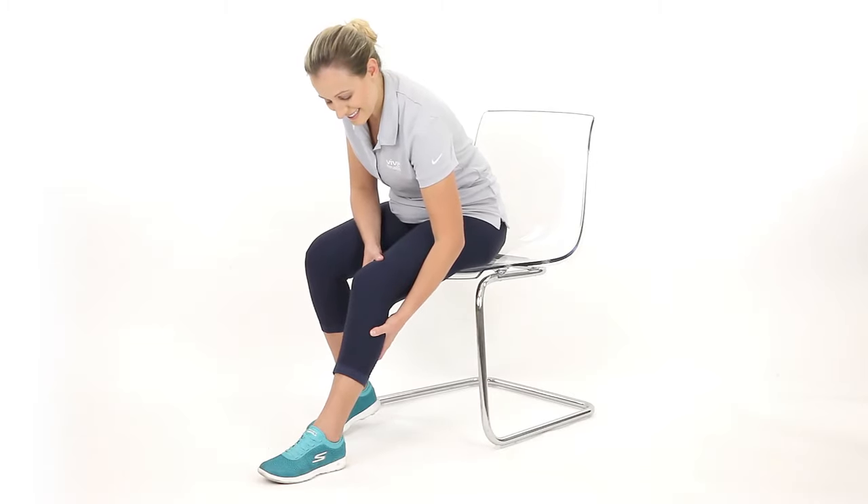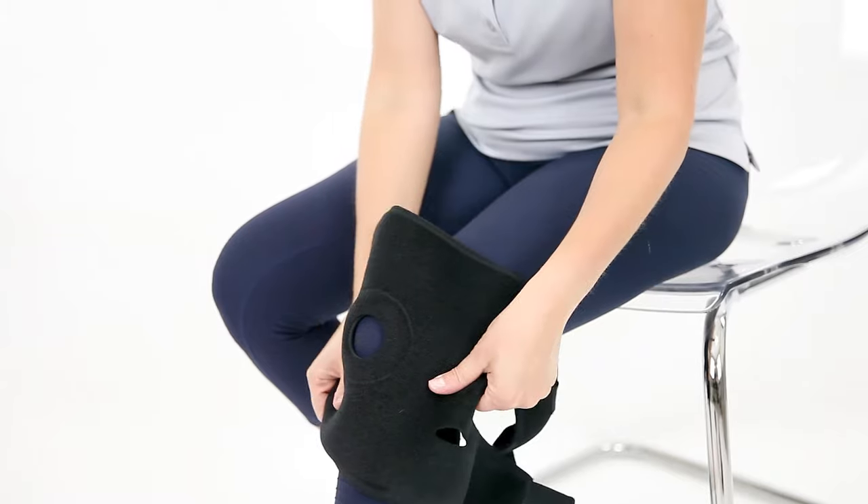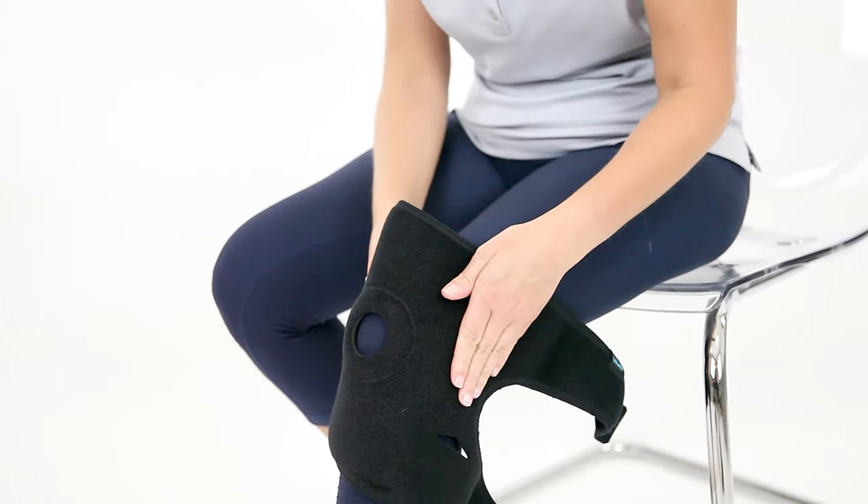In a seated position, extend your leg so the knee is straight. Position the open ring in the center of the brace directly on top of your patella and the long strap oriented at the top of the brace.